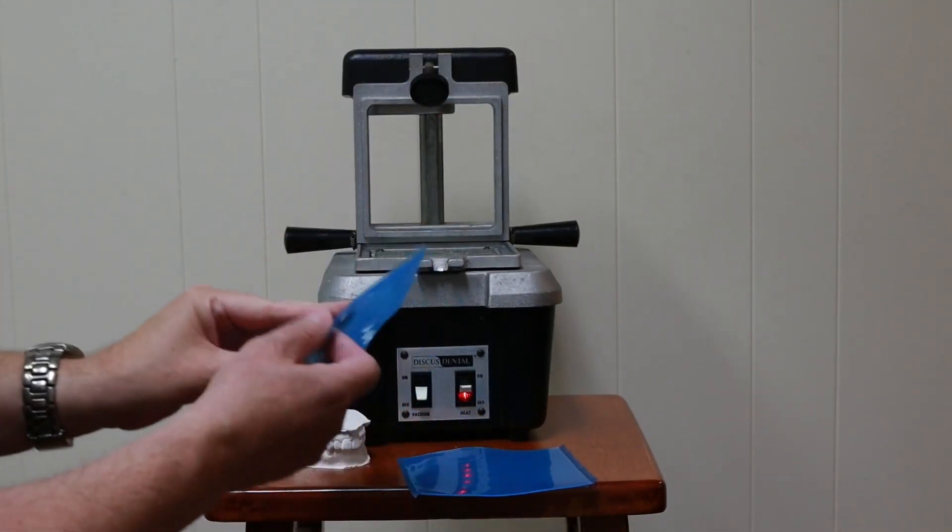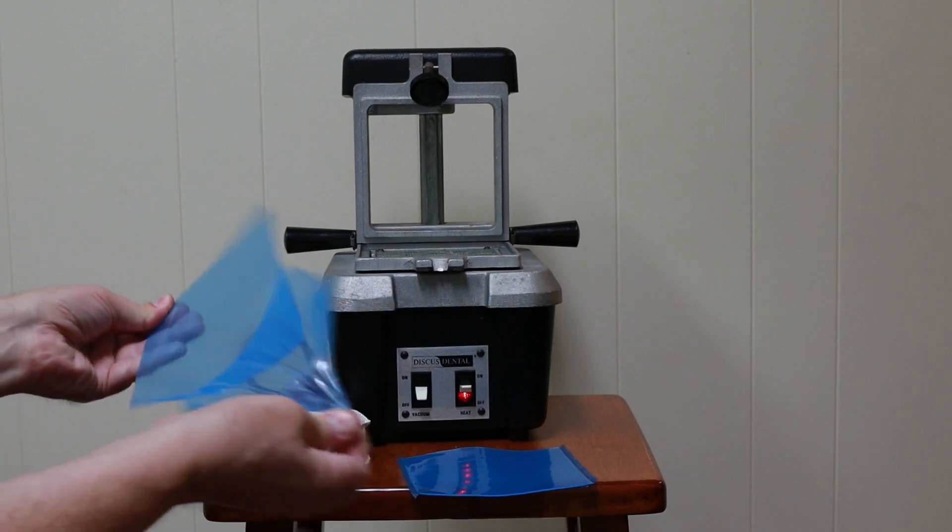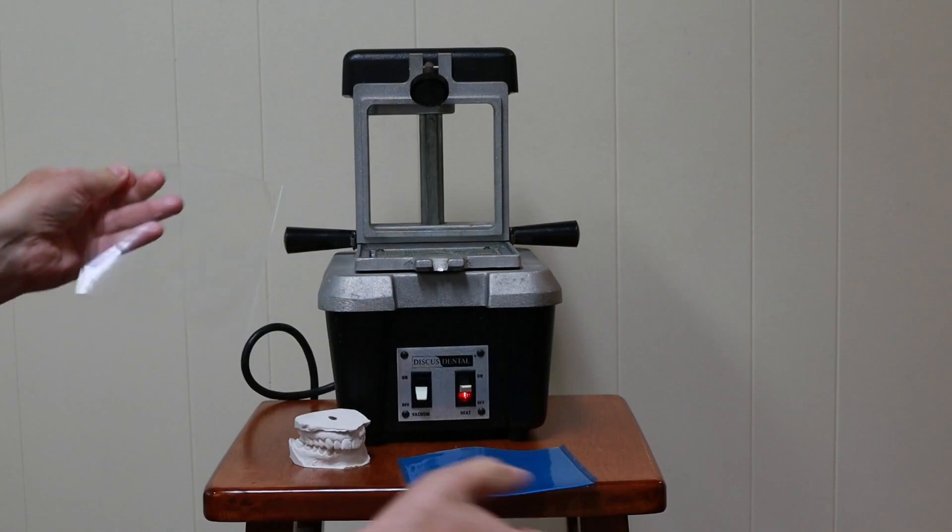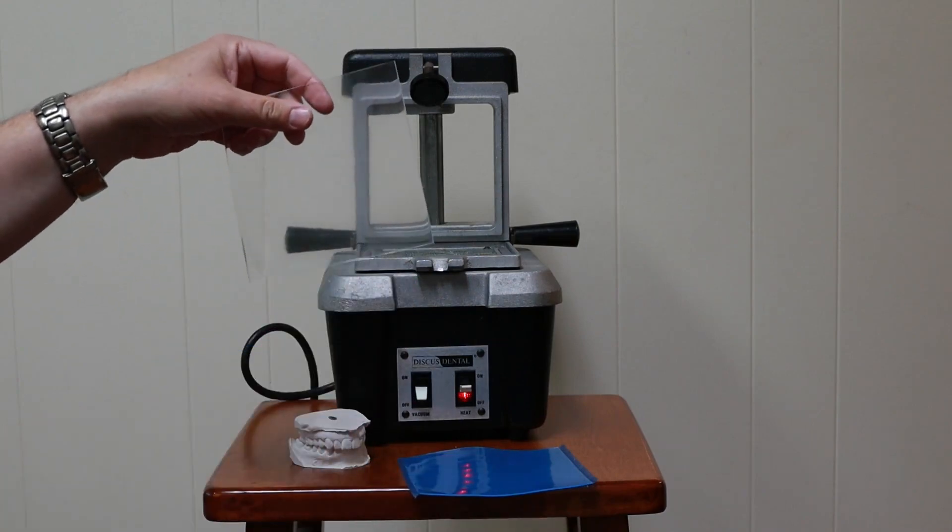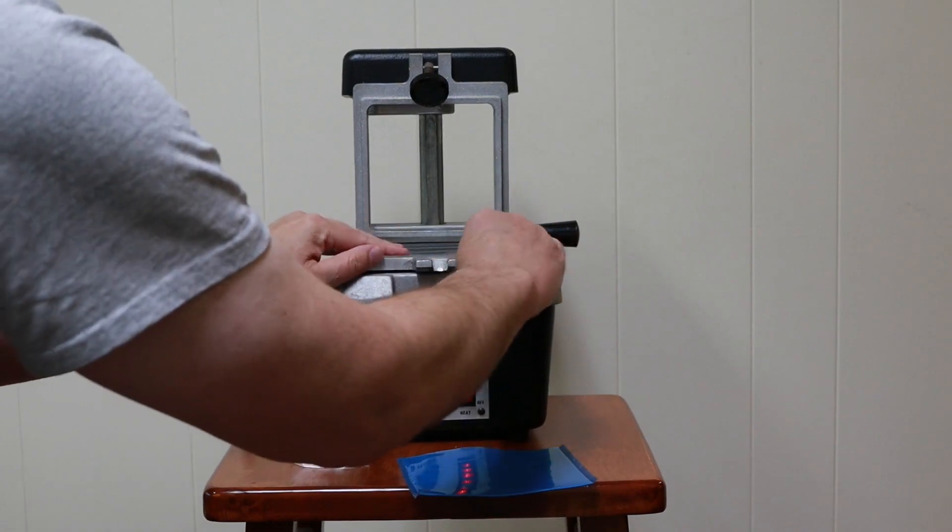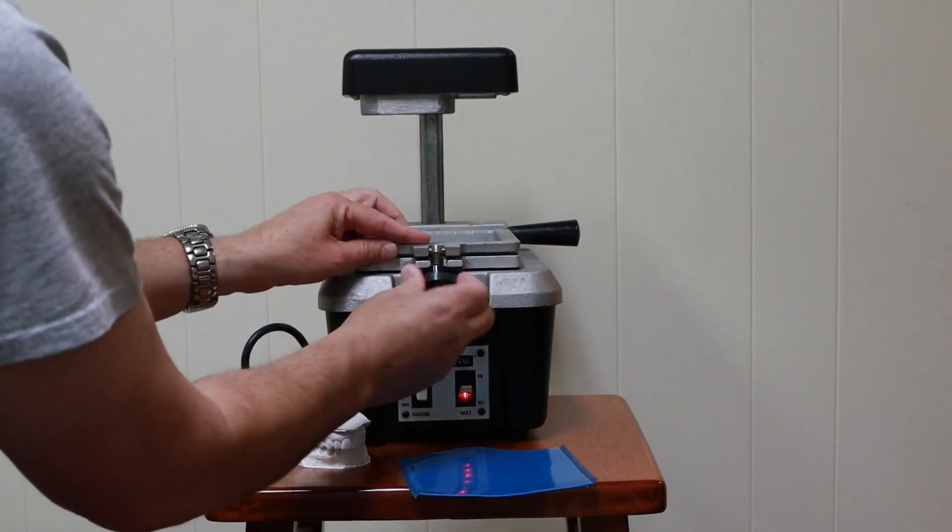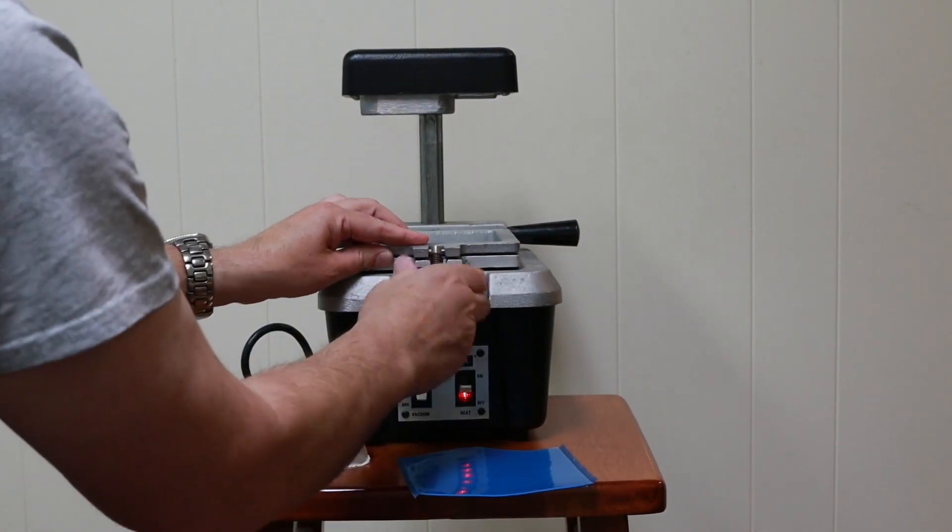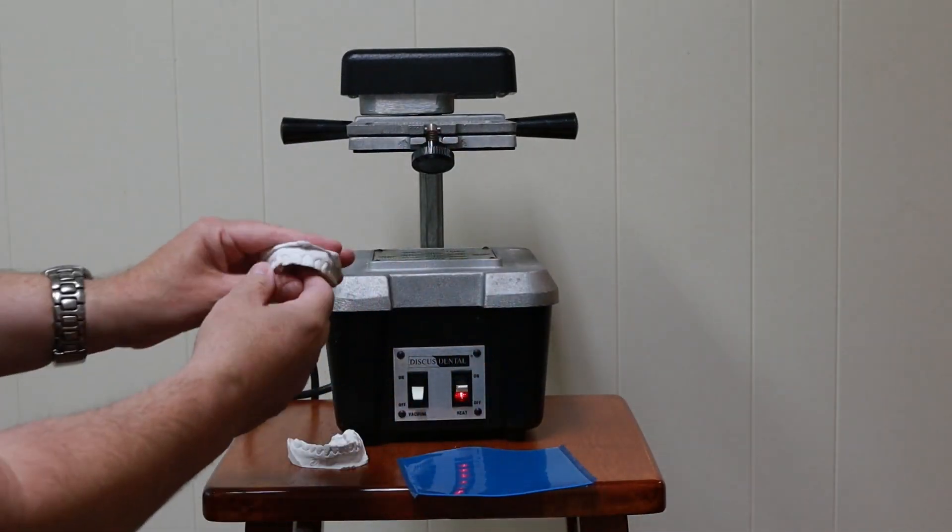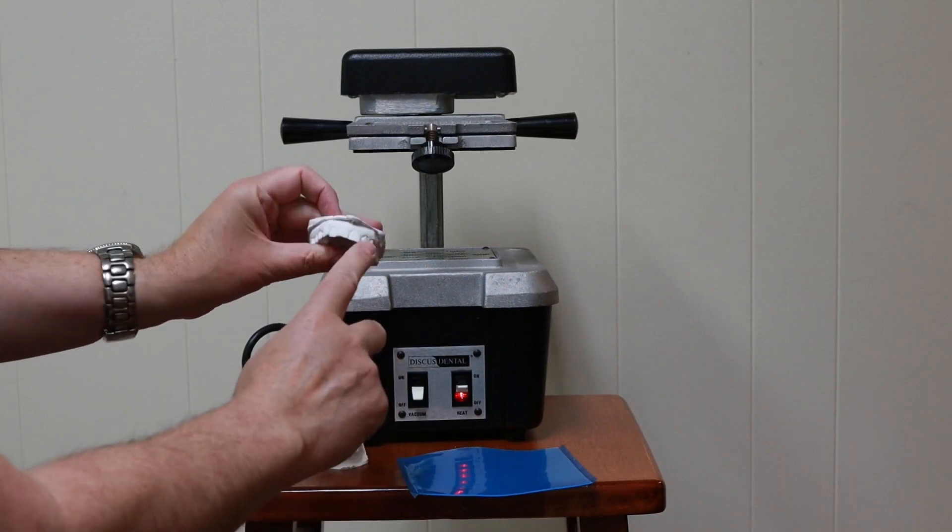This is the holder for the sheets. Let me get one of those. Got to peel off the protective plastic. Insert it in the vacuum forming machine. Cinch that down. Slide this up. And we'll do the upper model first.